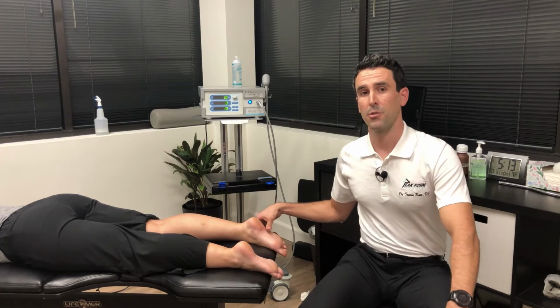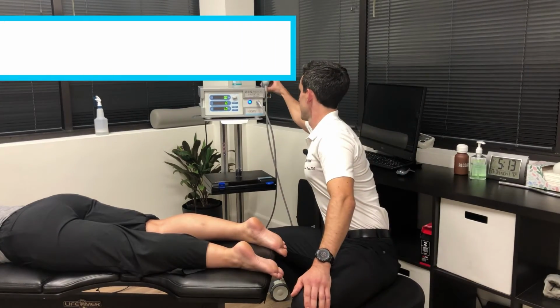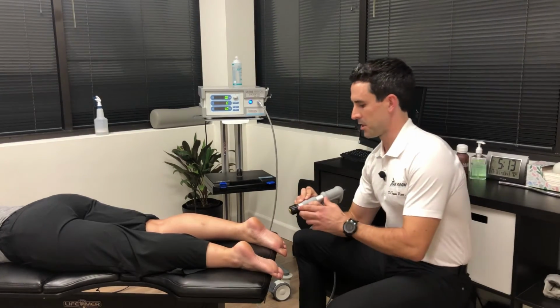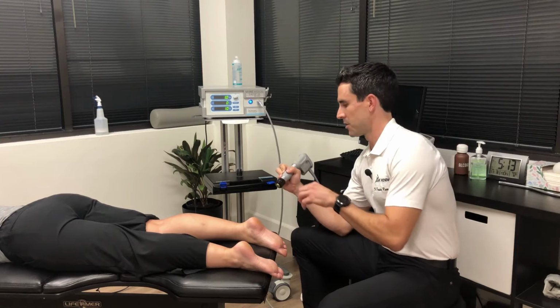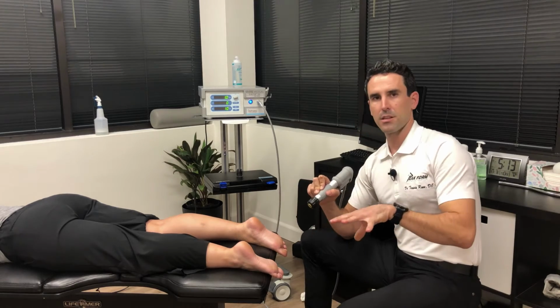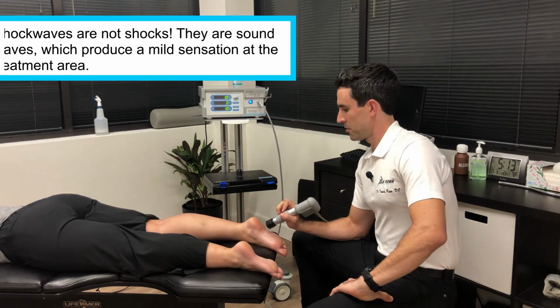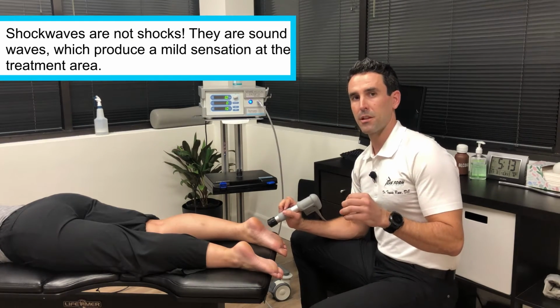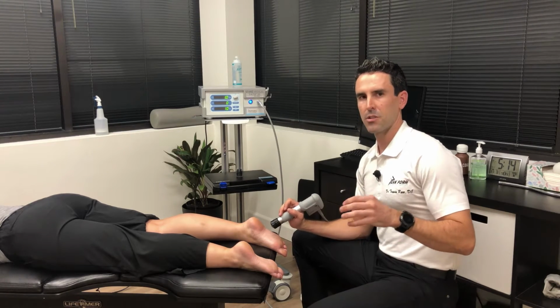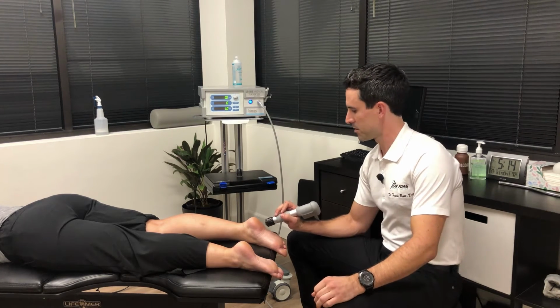So today we're going to go through a shockwave treatment, and shockwave is this device over here, and what it does is it sends acoustic waves into the tissues. So it essentially sends sound waves into the tissues. That sound wave goes into the tissues at a cellular level and causes a little bit of mechanical disruption at the area. In doing so, it will irritate the microvasculature in the area, so that will help increase some blood supply. Once it gets irritated, the body kind of sees it as a new injury and sends growth factors there to repair. So that increases that blood vessel formation and increases the blood supply to the area.